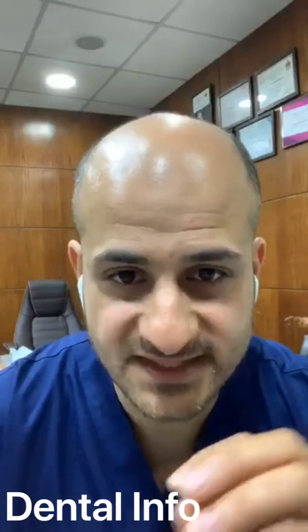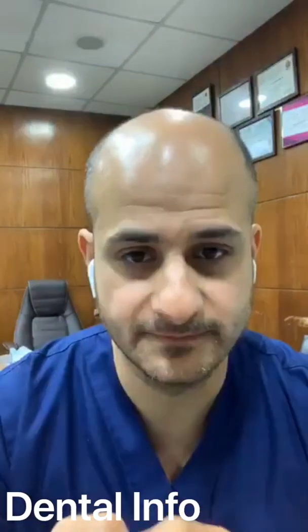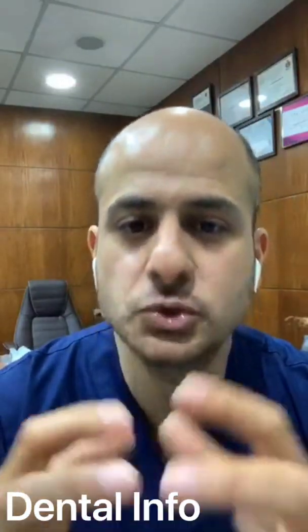Very good question from Dr. Bisan Oude. She's asking why we are not filling the entire canal, from the beginning to the end, without cutting, just with a fast fill. She's asking about what we call the squirting technique. It's an available, largely known technique, but the problem is that you have to have very good experience, and the learning curve of this technique is very big. So if you want to try it, you have to have very good training and know how to make it.